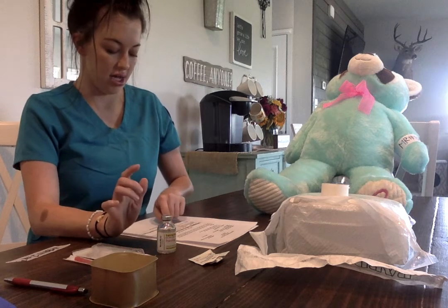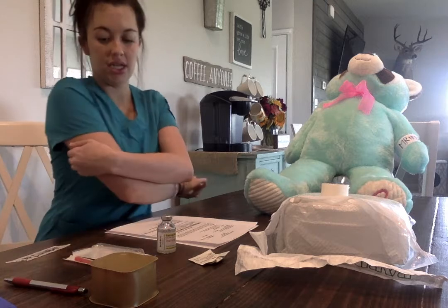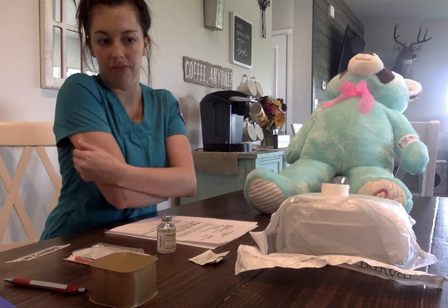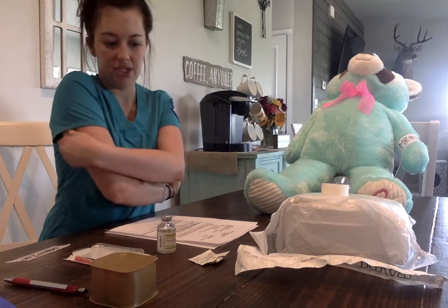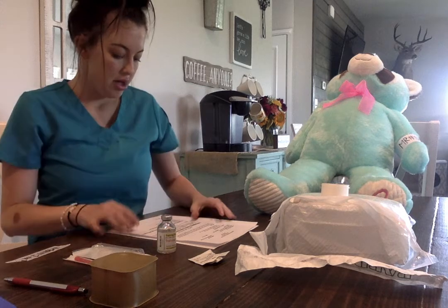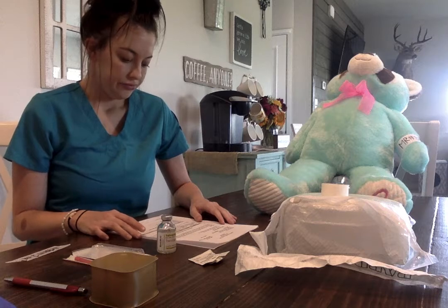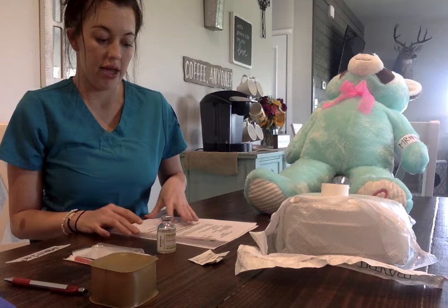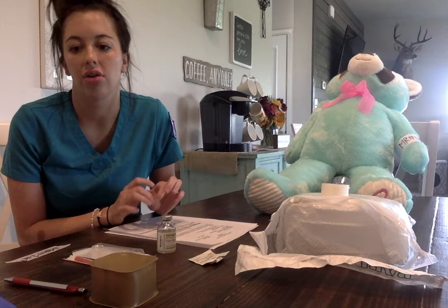I'm going to give it sub-Q, right here behind his arm, the upper, just behind right there. It is a blood thinning medication, and it's going to prevent blood clots during surgery and after surgery. So that's why we are going to give it to him.